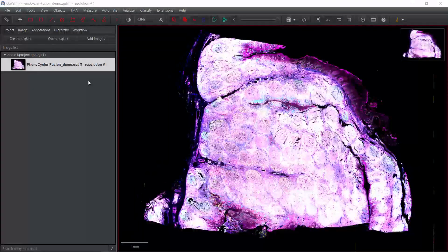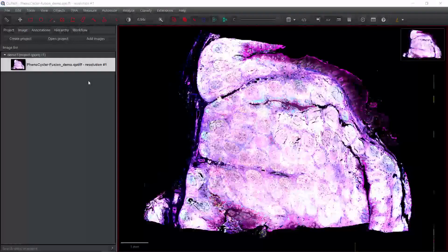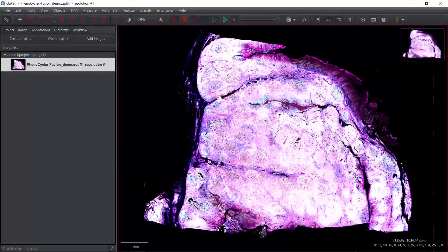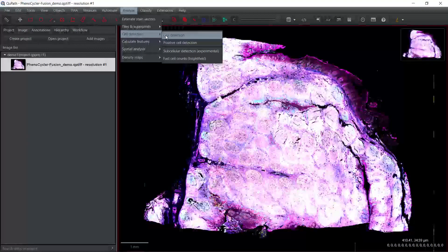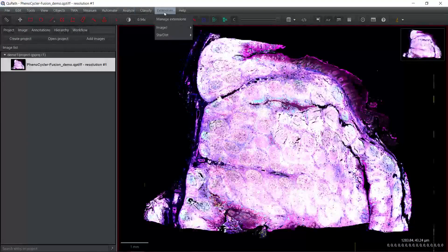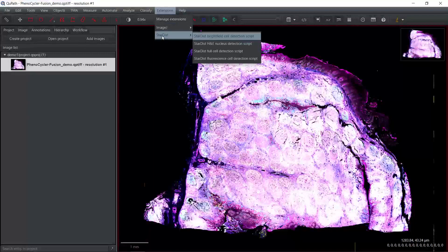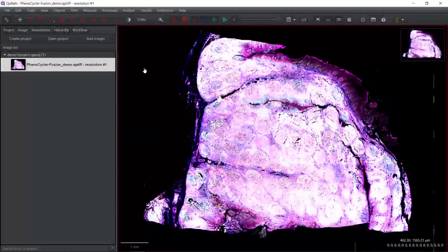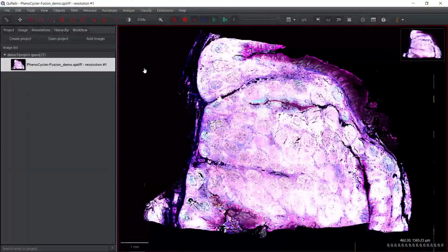Hello everyone, welcome to my QPath video tutorial. In my previous video tutorials, I showed you how to create the QPath project and also how to perform cell segmentation using the standard cell detection method and also the StarDist method. So today I'm going to show you how to perform multiplexed analysis.